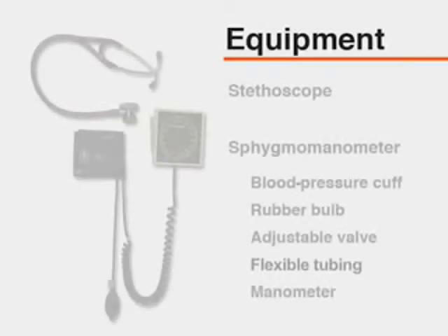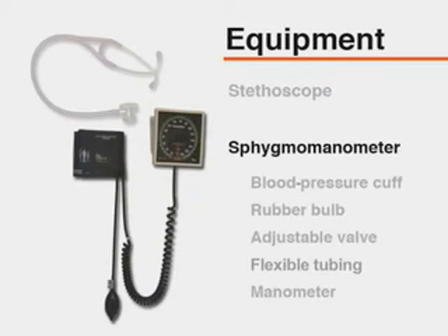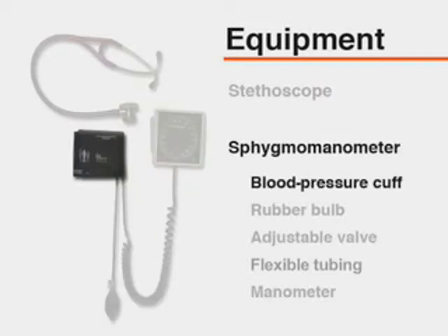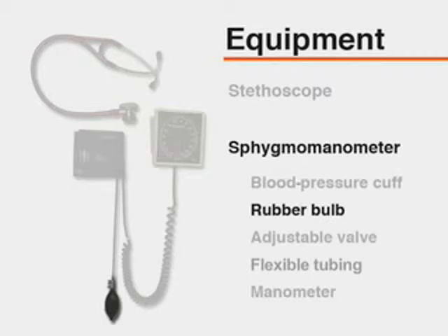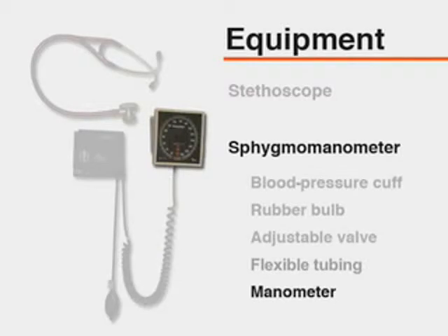The equipment necessary for measuring blood pressure includes a stethoscope. The stethoscope should have tubing of sufficient length for the clinician to hear Korotkoff sounds while viewing the manometer. The bell side of the stethoscope should be used as it permits better auscultation of Korotkoff sounds. A sphygmomanometer consists of a blood pressure cuff containing a distensible bladder, a rubber bulb, and an adjustable valve, as well as flexible tubing. Finally, a manometer documents the level of pressure within the cuff.